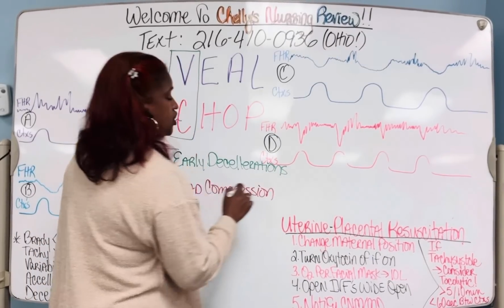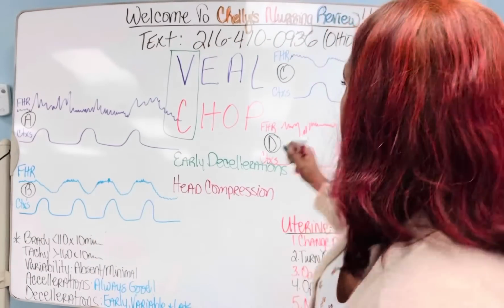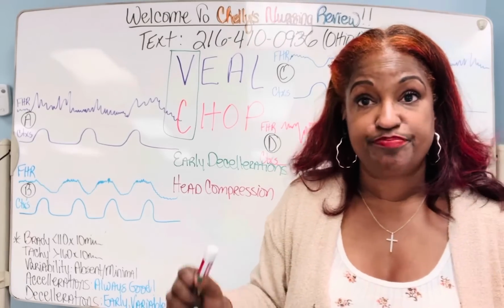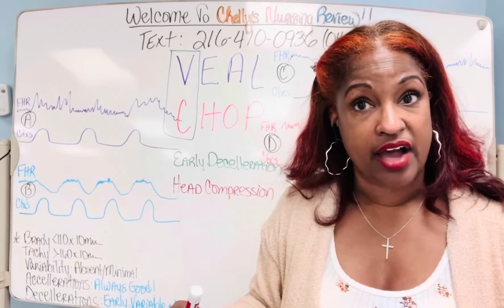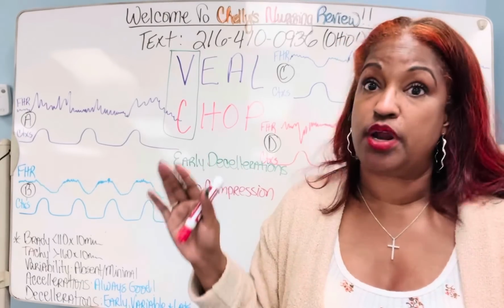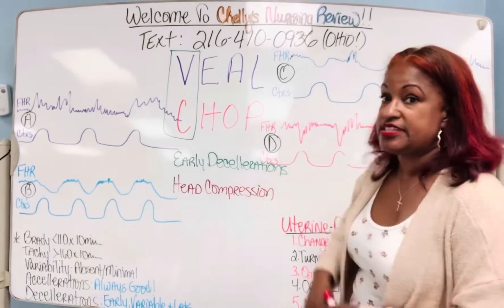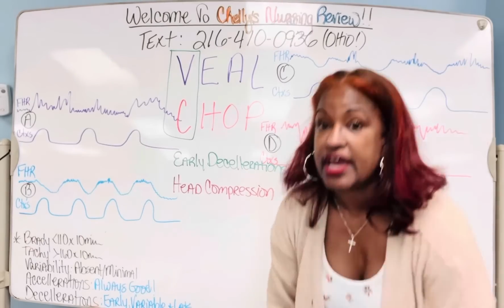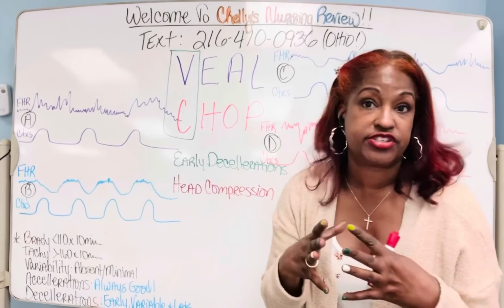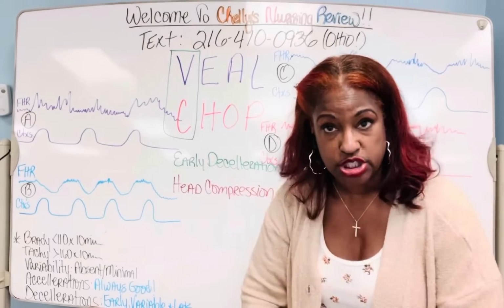Do you remember me saying that this patient with this strip was the Gravida 7 Para 6? Yeah, that lady had a lot of babies. She was coming in huffing and puffing and blowing and the baby's coming. Well, if the baby's coming out, then the head is being compressed or pushed on with every single contraction. Remember, the contraction does two things: squeezes and pushes.